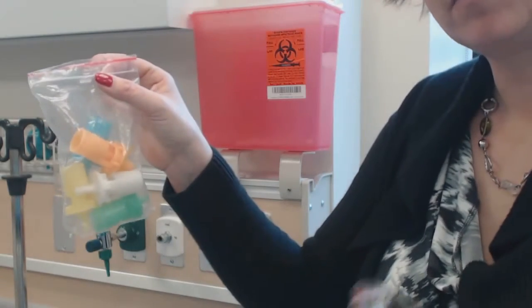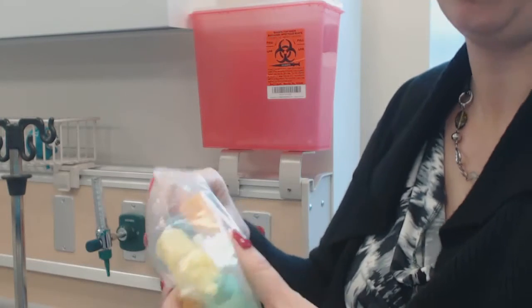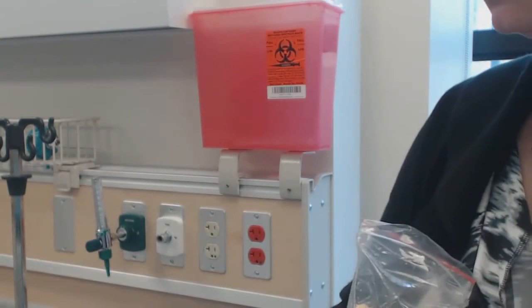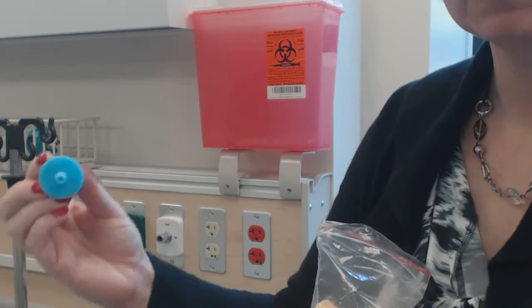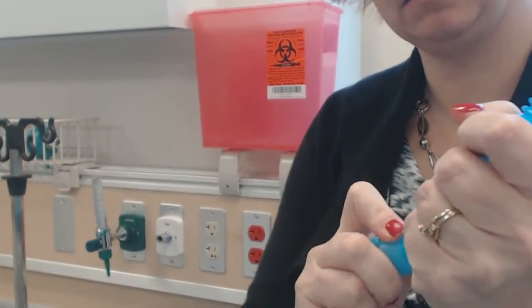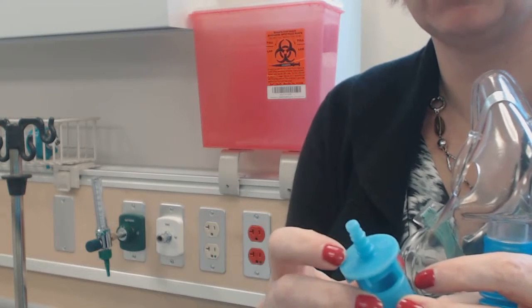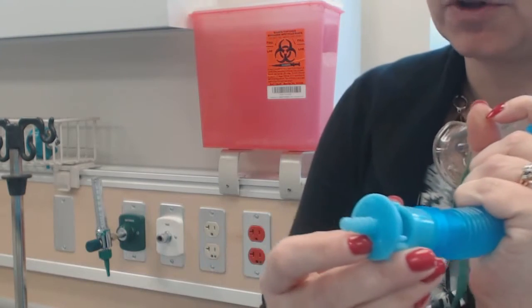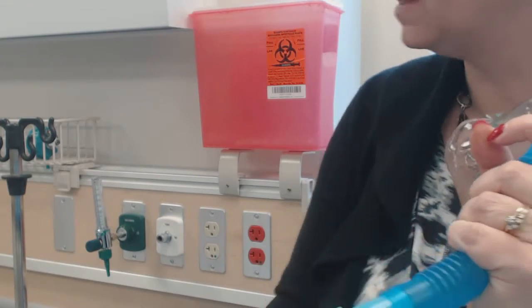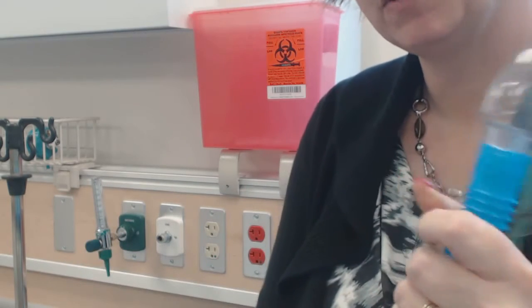This is what a Venturi mask looks like — it has all sorts of little attachments that come with it. You know how much oxygen you're giving by the attachment. So if the doctor tells you to place the patient on a 24% mask, you're going to put this one on. I know it's 24% because on the end it says 24%, and it also tells me to set the oxygen flow meter at 4 liters.